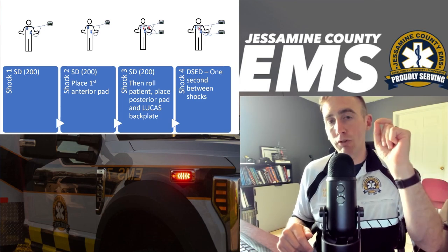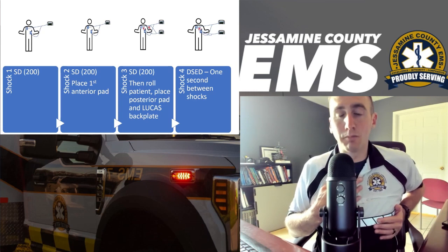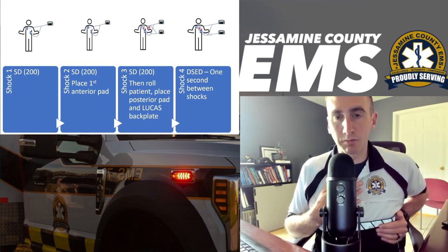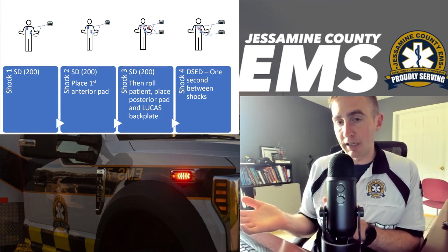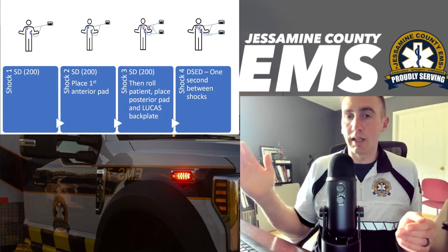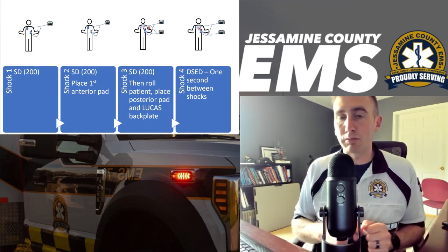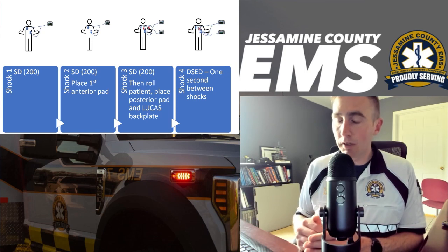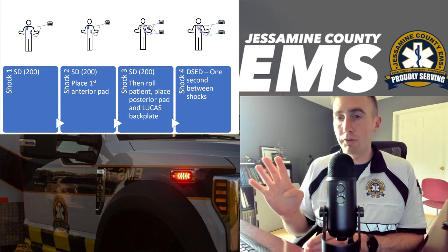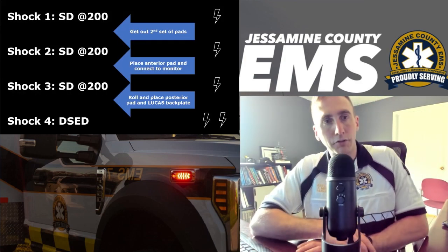Because after the third defibrillation with the standard placement, after that third shock, I'm then having the posterior pad ready to roll that patient and place it on the back. And at the same time, I am sliding in the Lucas backplate, rolling the patient back down. After the third shock, resuming CPR. And then on the fourth shock, we're going to do dual sequential on both monitors.